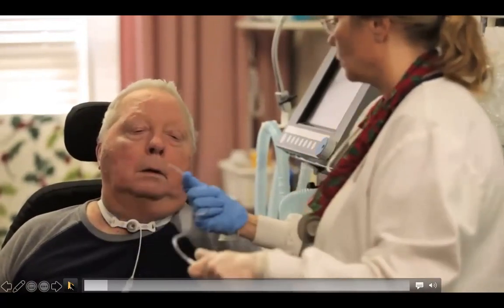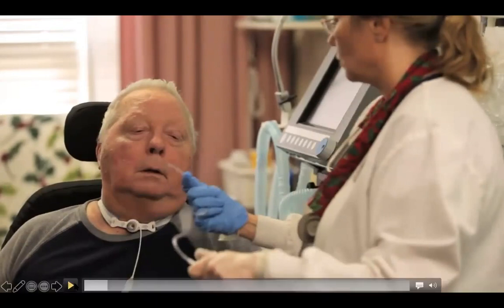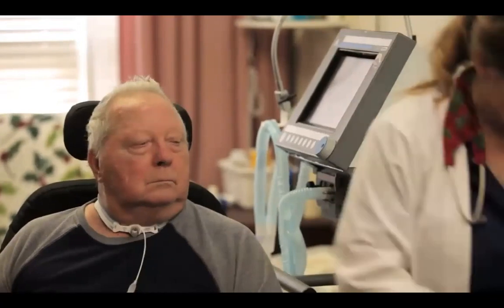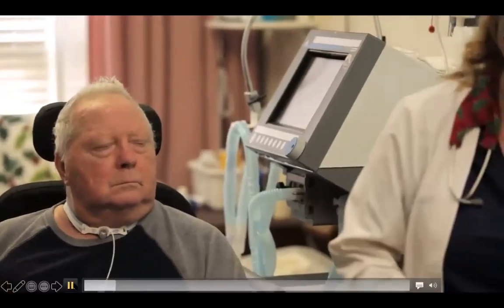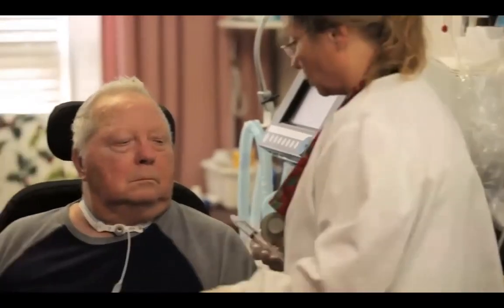Okay, so she's suctioning the patient to make sure that there are no secretions accumulating that could affect the speaking valve fitting. Not a whole lot there. Pretty clear. Now, the other thing is we might have to suction you again after we get the cuff down.